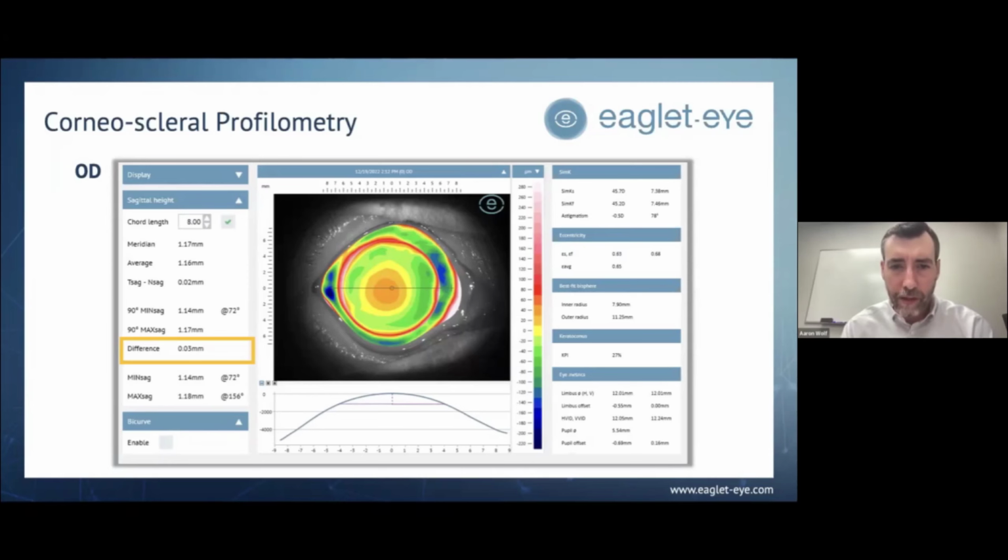As you can see in the infrared images, there's a Q-tip. I'm using a couple of cotton tip applicators to basically hold and pry the eyelid as wide as I can. And if you're used to seeing a lot of these Eaglet maps, you can really appreciate that this is a very small eye with very tight eyelids. I'm cranking that about as wide as I possibly can, and we're not getting a whole lot further out than the cornea. But the point is, and as mentioned in the previous case, I don't need a lot of data out there. I really just need corneal data out all the way to the limbus, and we clearly get that, and that's a nice quality map there.